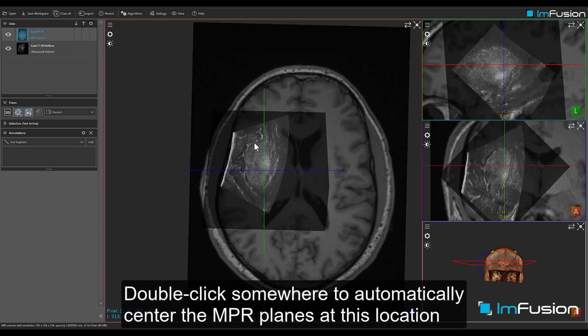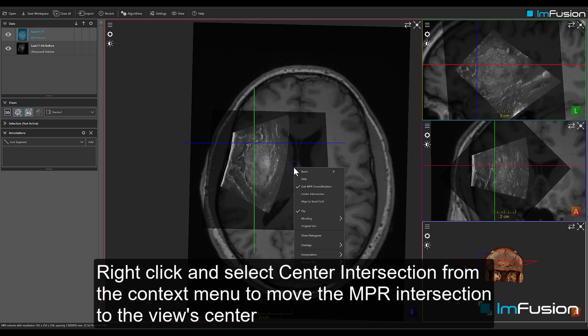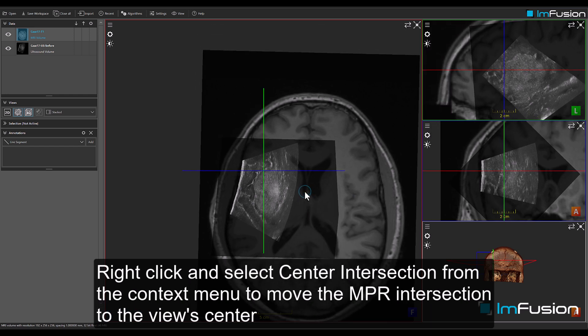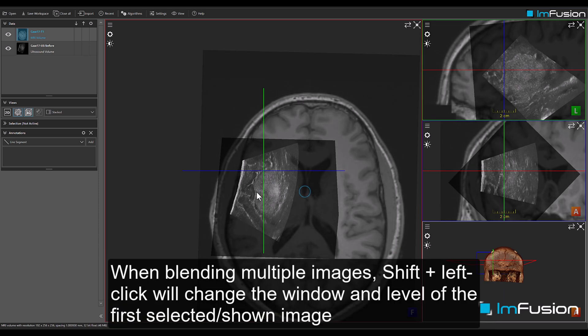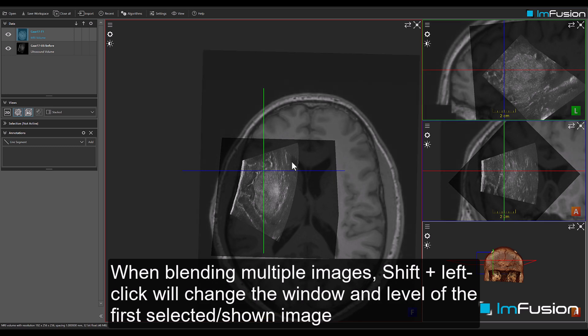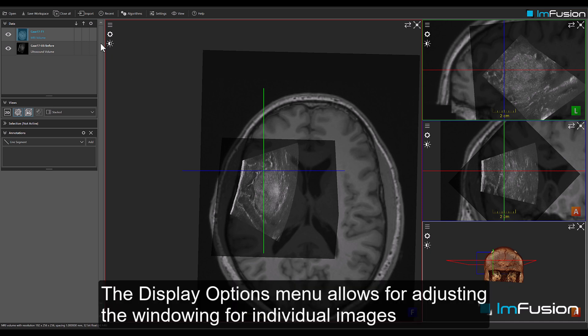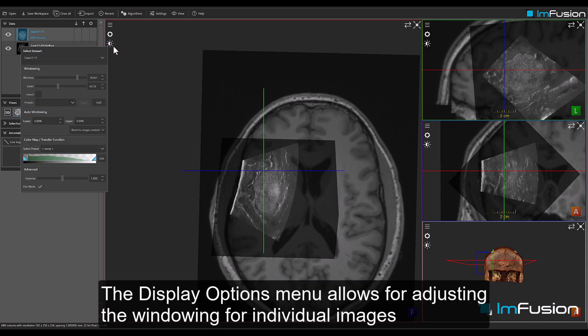Double-click somewhere to automatically center the MPR planes at that location. Right-click and select Center Intersection from the context menu to move the MPR intersection to the view's center. When blending multiple images, Shift and left-click will change the window and level of the first selected or shown image. The display options menu allows for adjusting the windowing for individual images.